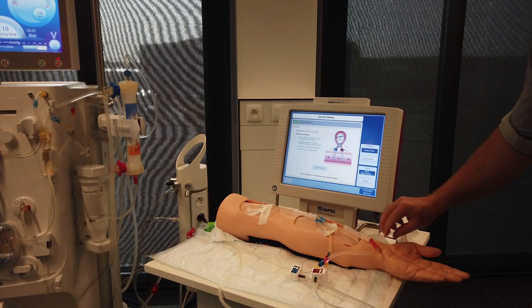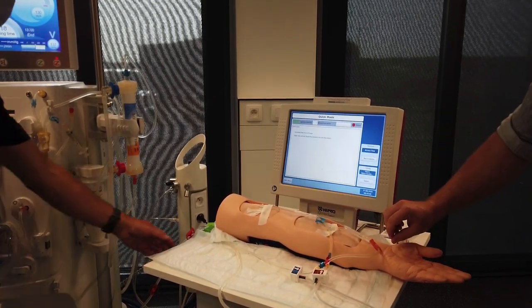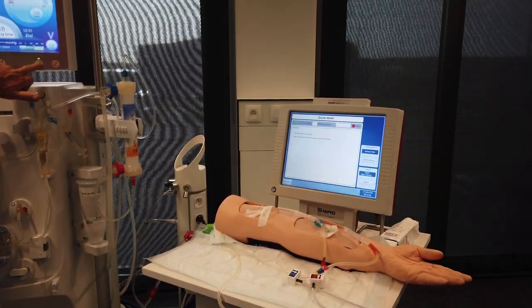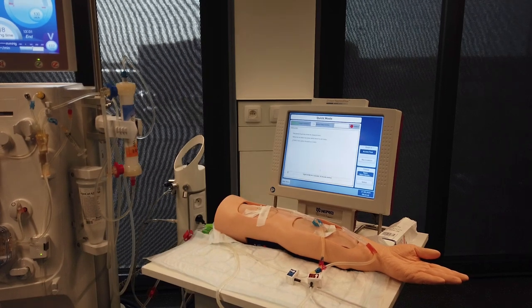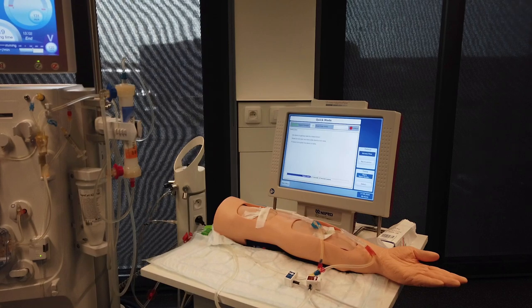Press offset and keep the clamps closed. After successful offset, open the clamps and restart the blood pump. The device detects the flow and will show a green light when it is ready for the measurement.